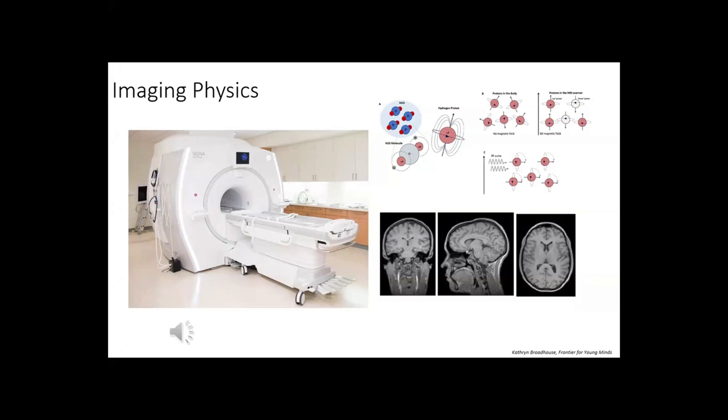Usually when you're going to take an MR scan, you just lie down on that table. They will put a coil on here, something like a helmet, on your head. And they will give you earbuds, because this machine is very, very loud. Then the people who help you put the coil on will leave the room. They will go to a computer room, and they push the button, and then you're going into this machine.